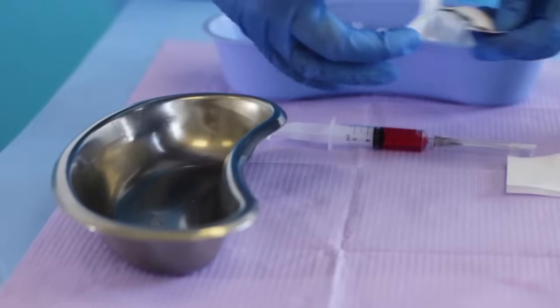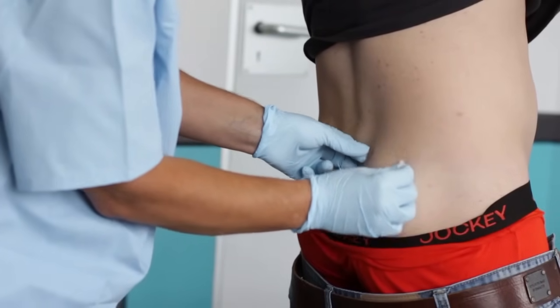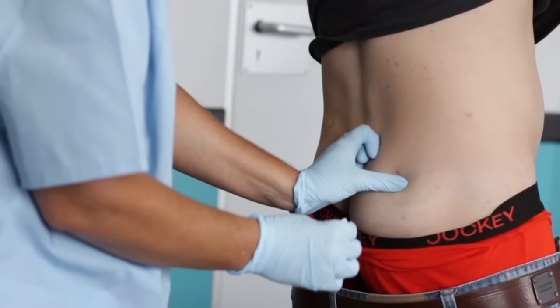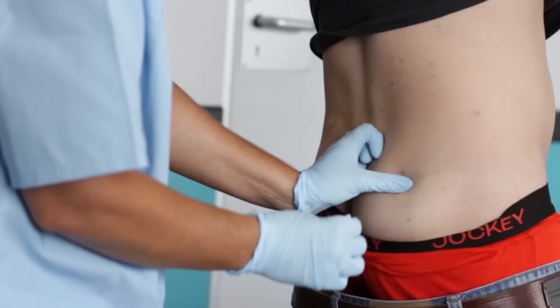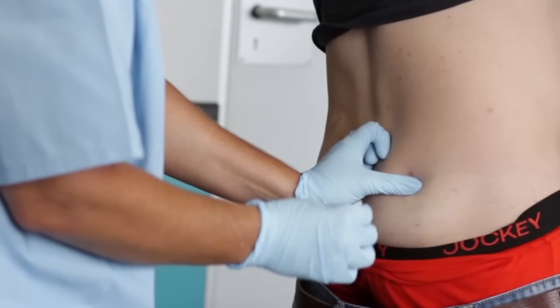Wipe the injection site with an alcohol pad for 30 seconds in an outward circular motion up to 5 centimeters around. Allow the site to air dry for 30 seconds. Open the index finger and thumb of the non-dominant hand about 2 inches or 5 centimeters, place them on either side of the planned injection spot, and then gently spread finger and thumb to tense the tissue.